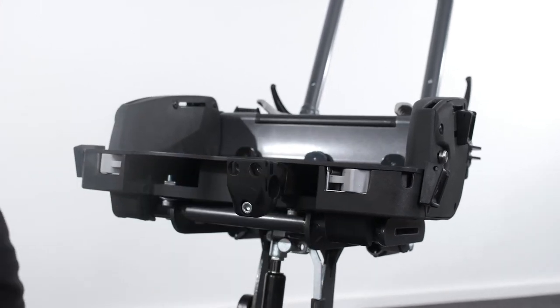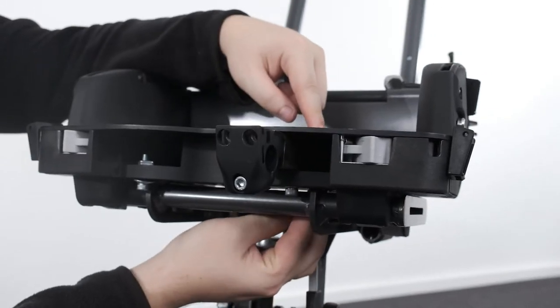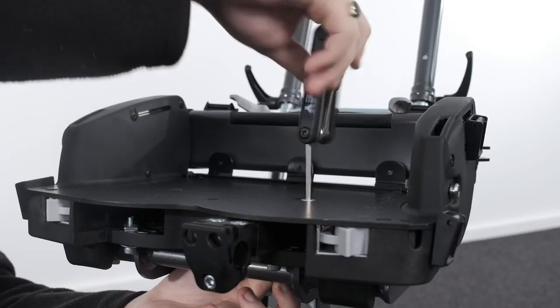Insert the countersunk screw into the seat base cover plate and secure underneath with the nut supplied, retained within the recess in the molding. Repeat for the other side.